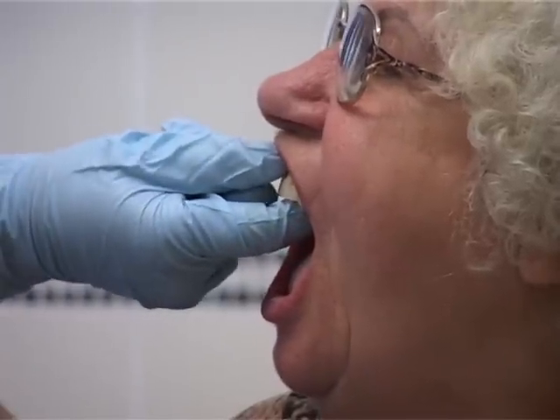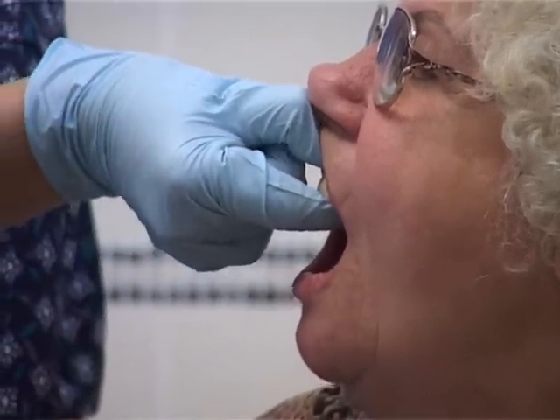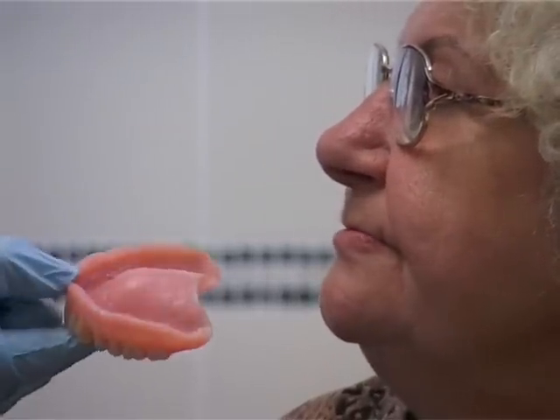Upper full dentures can have a lot of suction holding them up. You need to break the seal between the denture and the palate. Try holding the front teeth with your thumb and index finger and rocking the denture so that the back of the denture is dislodged.